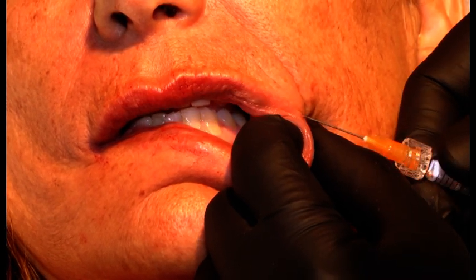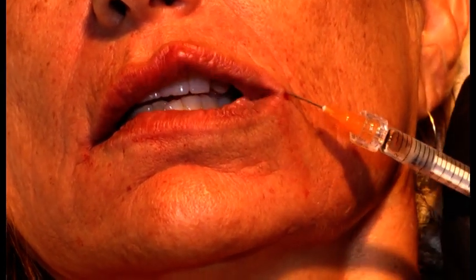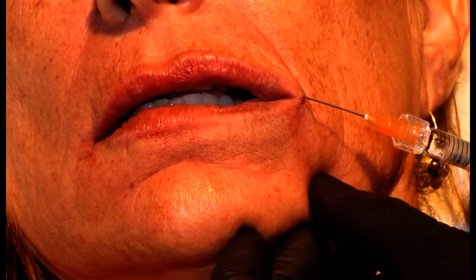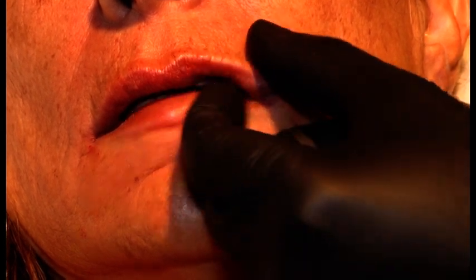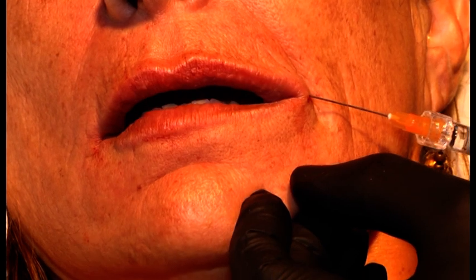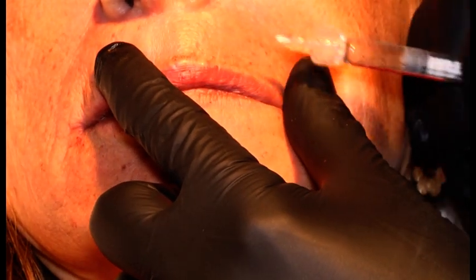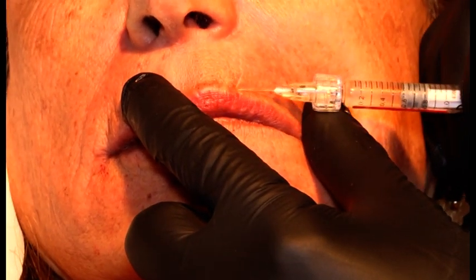And now, as you can see, I'm also introducing the cannula into the vermilion in the dry portion of the red lip, and I'm also injecting some product in the vermilion on this side. More contour. And of course the blanching you cannot do with the cannula, so you have to do that with the needle.